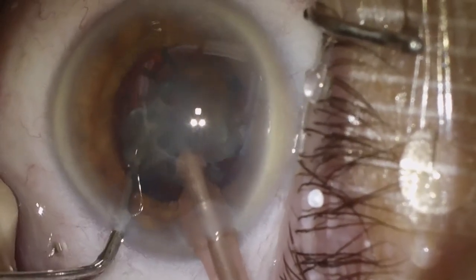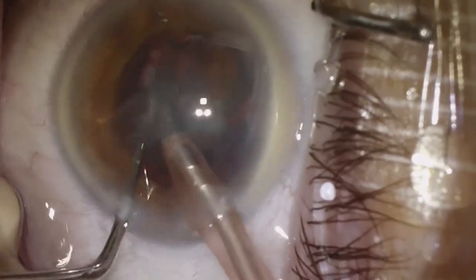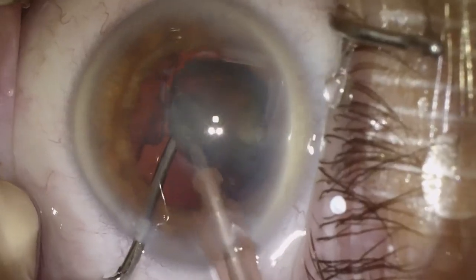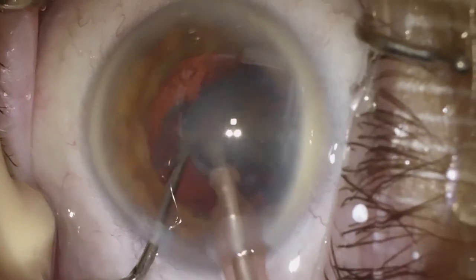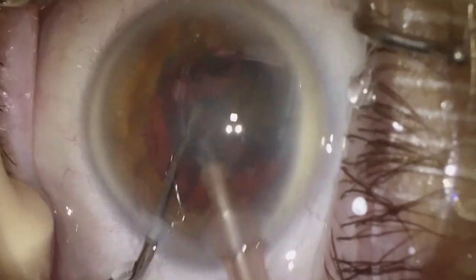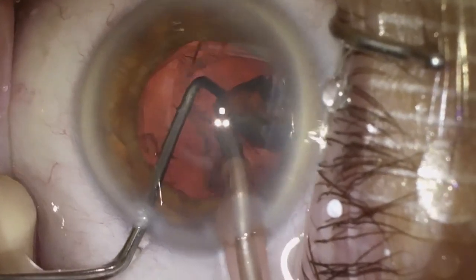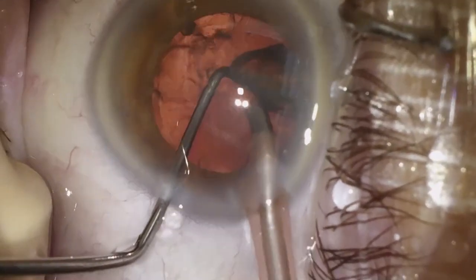I just did a mini chop there. I chopped the piece. It wasn't tumbling, so I used my second instrument to chop that quadrant into smaller pieces. Just anything to keep things moving along here. Very nice. Making good progress. Not much cortex there.